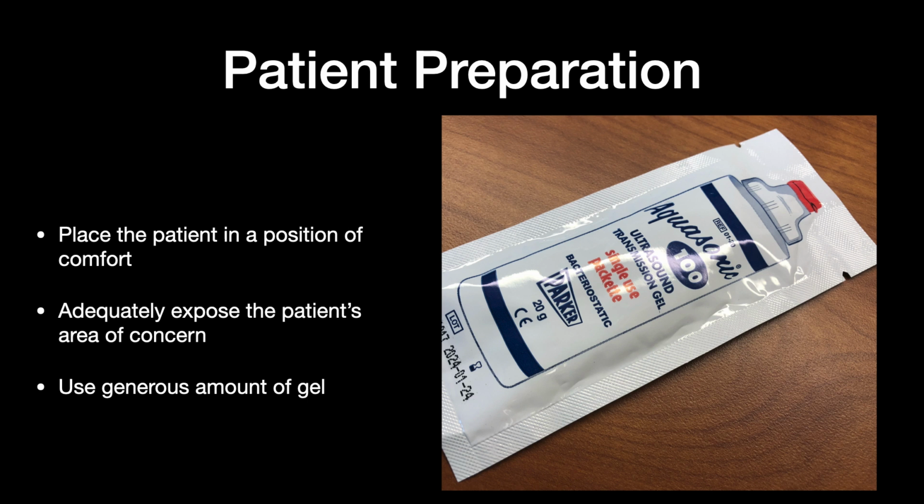So that's the first thing. Position the patient in their position of comfort, primarily. Secondarily, position them in a place where you can be comfortable while scanning so you're not hurting yourself. And as a brief aside, if you want more details on how to do that, go back to the YouTube channel. We have a lecture about the ergonomics of ultrasound and how to maximize that. Go back and check that one out. We did that one a little over a year ago. It's a pretty good lecture. But anyway, back to this here.